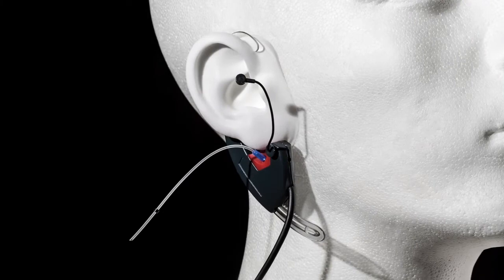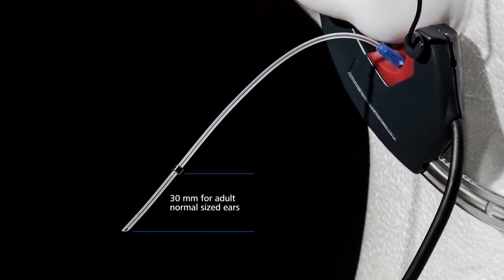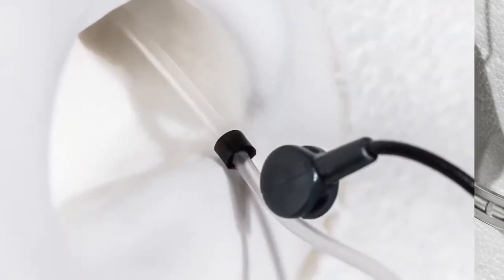Move the marker on the probe tube to indicate the necessary length of the tube. As a rule of thumb, the marker distance from the tip of the probe tube should be 30 mm for adult normal-sized ears and 26 to 28 mm for adult small ears. For pediatric fitting, always use the ear impression to determine the necessary tube length.